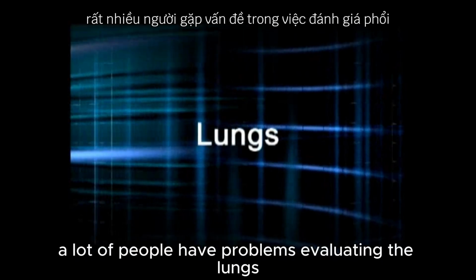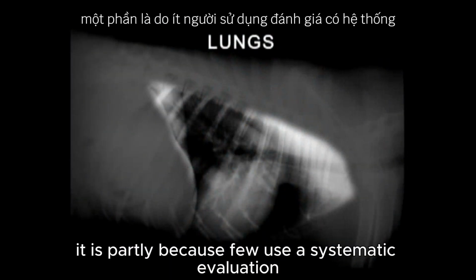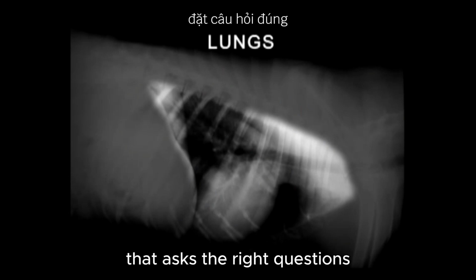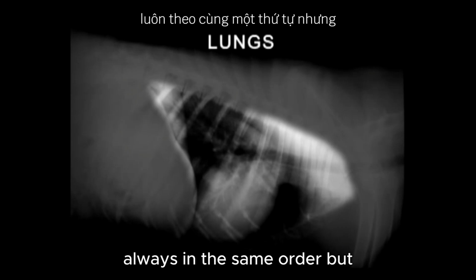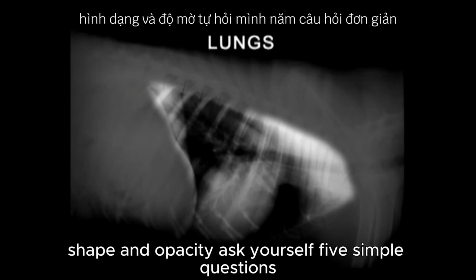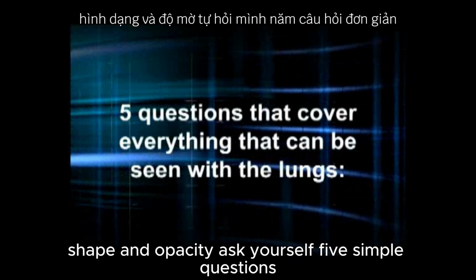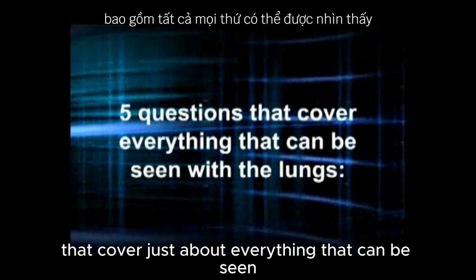A lot of people have problems evaluating the lungs on thoracic radiographs. It is partly because few use a systematic evaluation that asks the right questions. As with the previous parts of the thorax, look at all the structures, always in the same order, but instead of asking if there is anything abnormal about location, size, shape, and opacity, ask yourself 5 simple questions that cover just about everything that can be seen about the lungs on radiographs.